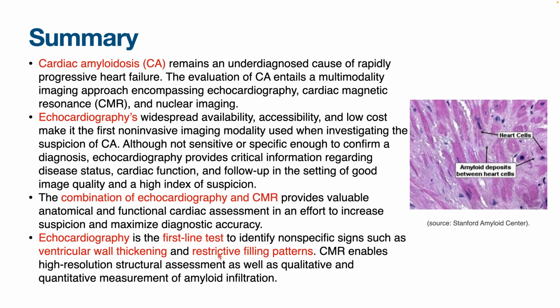Although not being highly sensitive nor specific to confirm the diagnosis, echo provides critical information regarding disease status, cardiac function, and follow-up in the setting of good image quality, and among us as clinicians, high index of suspicion. The combination of echo and MRI provides a valuable anatomical functional cardiac assessment in an effort to increase suspicion and maximize diagnostic accuracy, and obviously nuclear as well, because that's one way that we can screen patients, and we do that at St. Michael's Hospital, thanks to Dr.